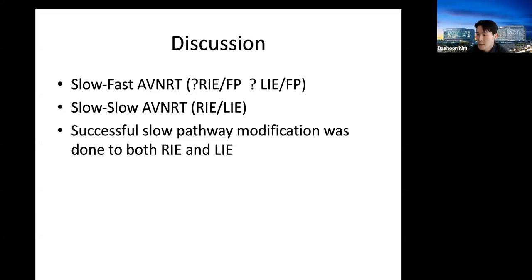Yeah, hello, my name is Taeyeon Hwang, and thank you for sharing your very excellent case. I have several questions about the procedure. The first, was there any particular reason that you selected the initial diagnostic catheters, because you did not position the separate right side atrial catheter at the beginning of the procedure?